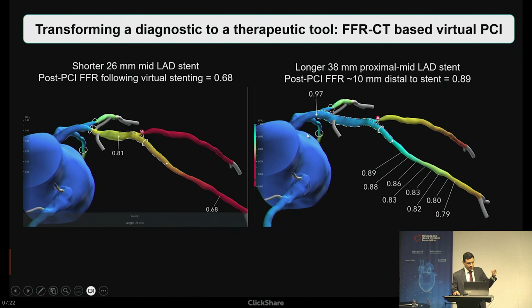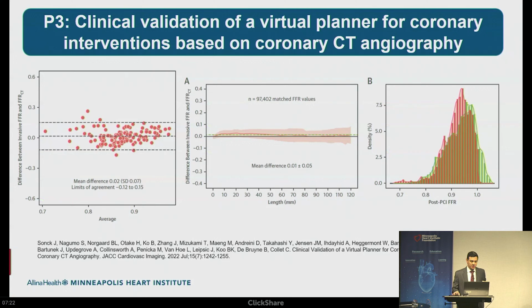This is an important evolution in coronary physiology, and we probably appreciate how important it is for discussions with patients about expectations, and for us as operators about what can or cannot be achieved in the cath lab, and what our results are despite sometimes great cosmetic big stents in some areas.